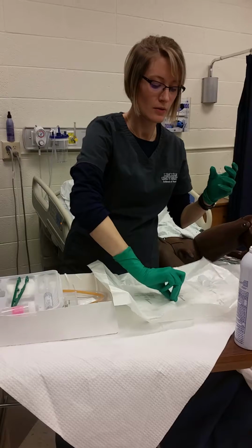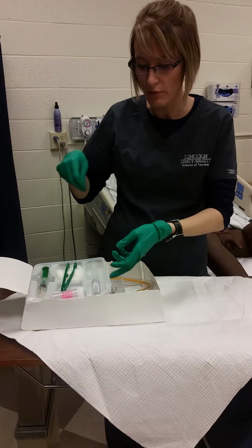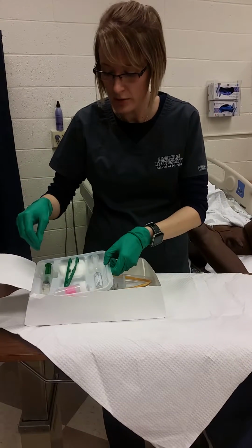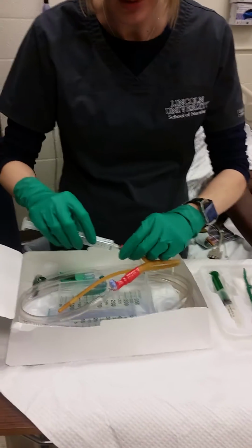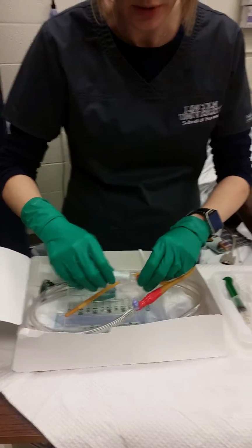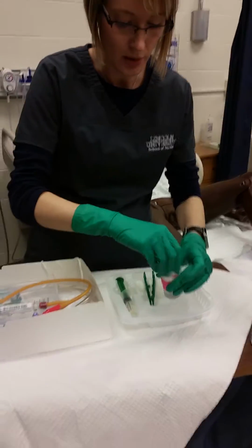And I would take this and throw it away above waist level. So I'm going to go ahead and set up my supplies before I get started. I'm going to attach my saline syringe to the port so I can inflate the balloon when I'm ready. Set up my sterile lubricant.